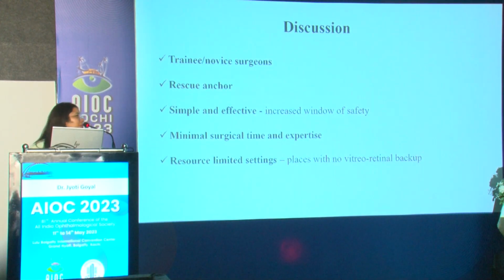Finally, I would like to conclude that this technique is very useful for trainee or novice surgeons, especially when they have many maneuvers to do, because there is more chance of haptic slippage in these novice surgeons.